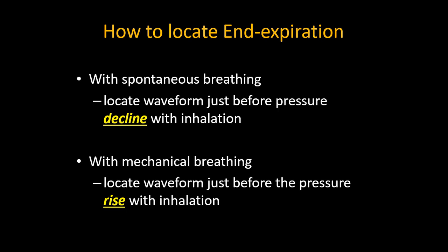So how to locate end expiration? In a spontaneously breathing patient, locate the waveform just before the pressure decline on inhalation. And in a mechanically ventilated patient, locate the waveform just before the pressure rises with inhalation.